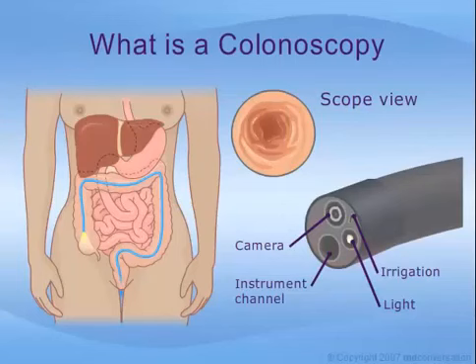wish. Colonoscopy is a test that allows your gastroenterologist or surgeon to look at the interior lining of your large intestine, which includes the rectum and colon, using a thin, flexible instrument called a colonoscope. A colonoscopy helps the doctor view possible ulcers, polyps, growths, or tumors and see areas of inflammation or bleeding. During a colonoscopy, tissue samples can be collected and abnormal growths can be removed.